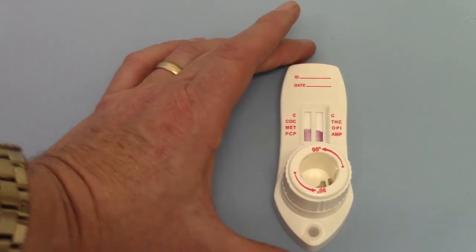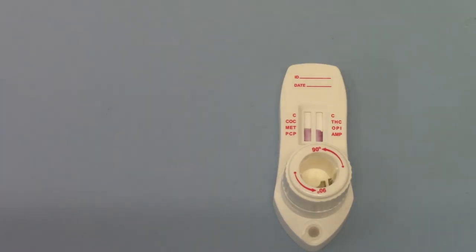So now what's happening is the test membranes are running. Obviously one will run slightly ahead of the other depending on which one was triggered first. As soon as you start the first trigger, you need your timer to start and the read time for this test is between 5 and 10 minutes.